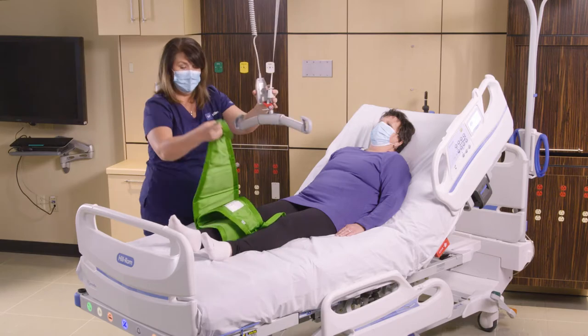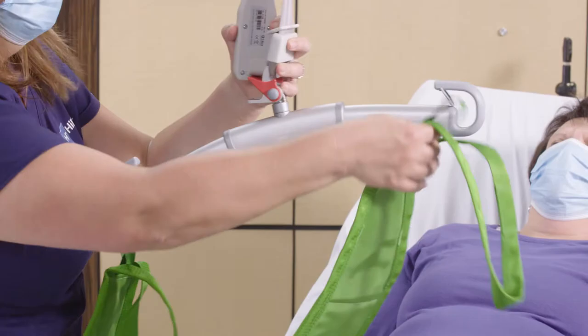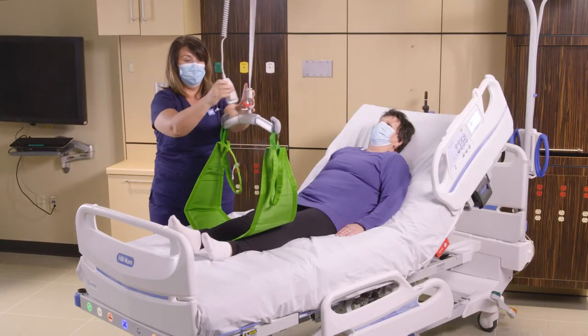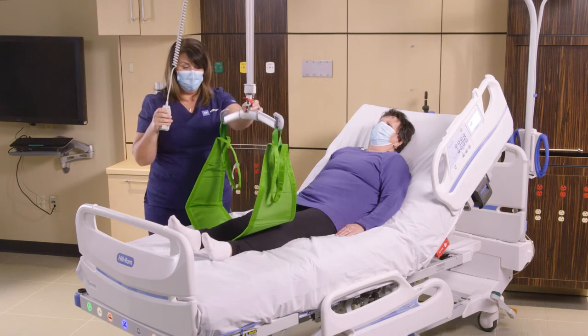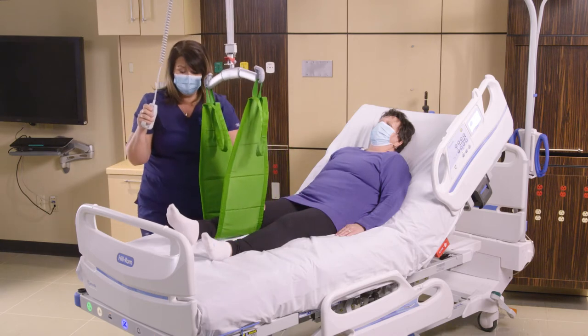We can attach the Multi-Strap to our sling bar on the left and attach it on the right, making sure again that everything is seated in the sling bar. Then we can go ahead and raise the lift, elevating the limb off of the surface.